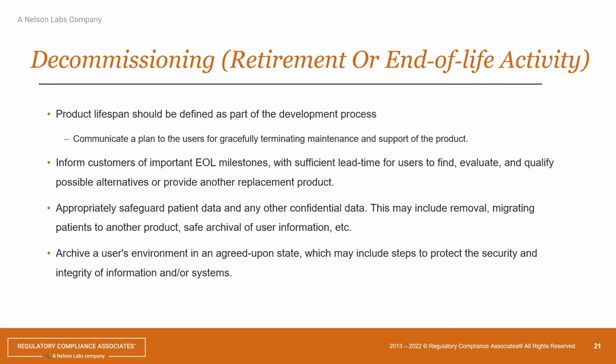If there's any data that needs to be transferred or preserved, they have the opportunity to do that. And you take into account data integrity, security, all of those things being in place for your decommissioning.